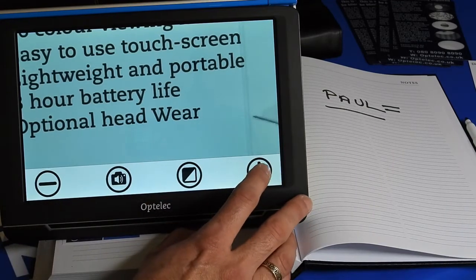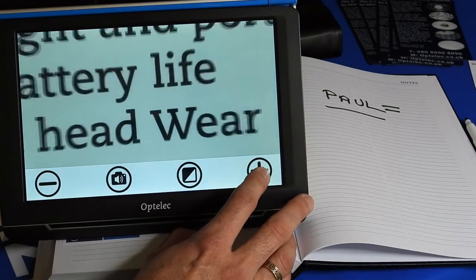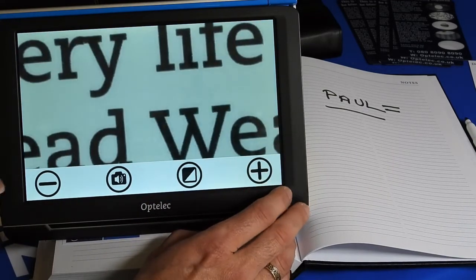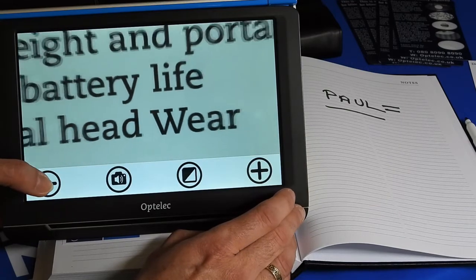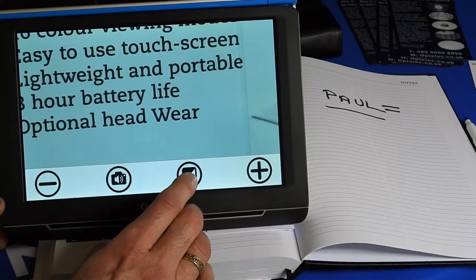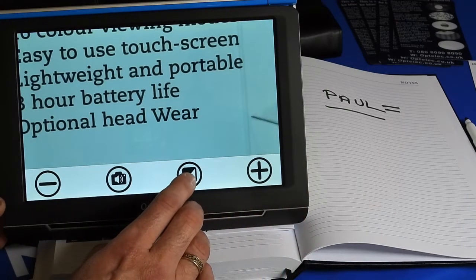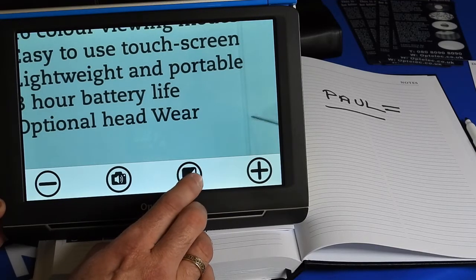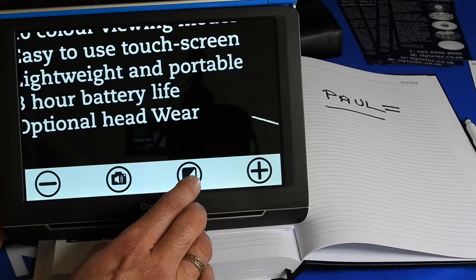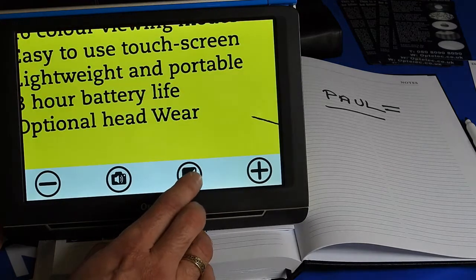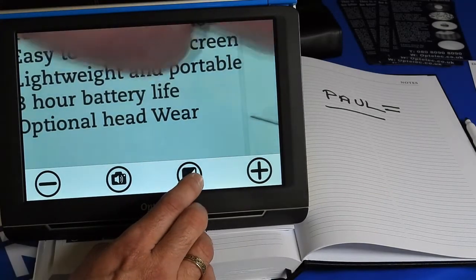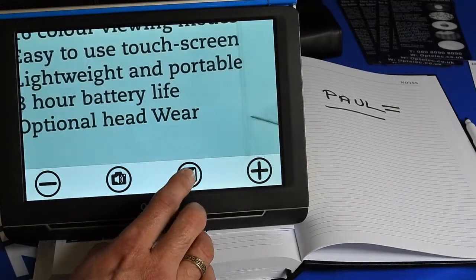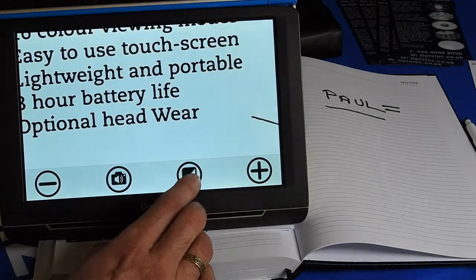Button on the right hand side to increase magnification. Button on the left hand side to decrease magnification. Button slightly to the right in the middle changes the contrast, and you can cycle through various contrasts from natural colors to high contrast black and white.